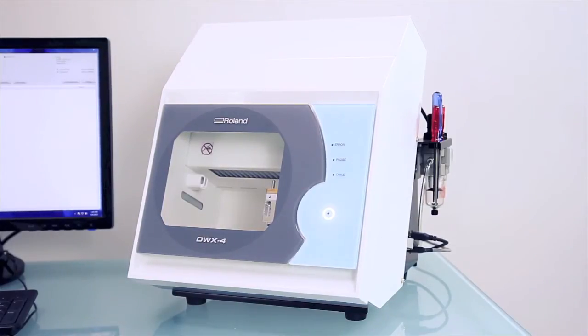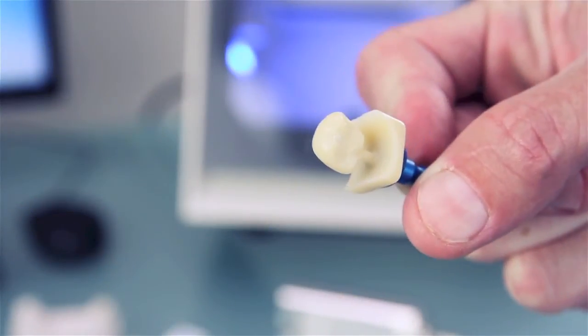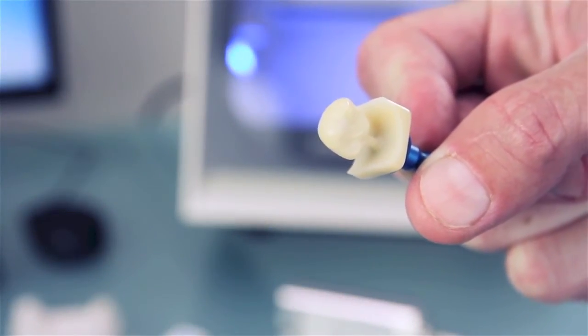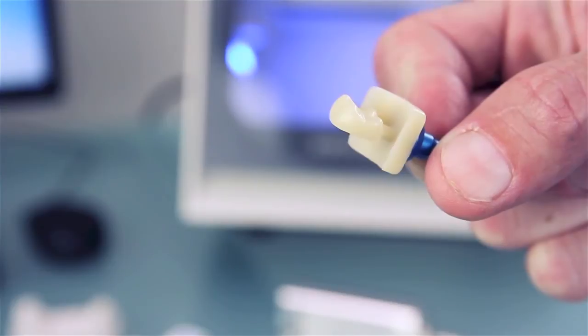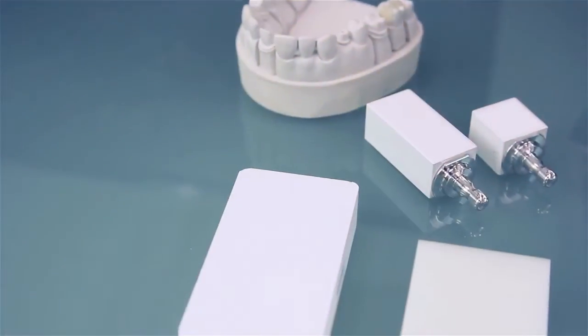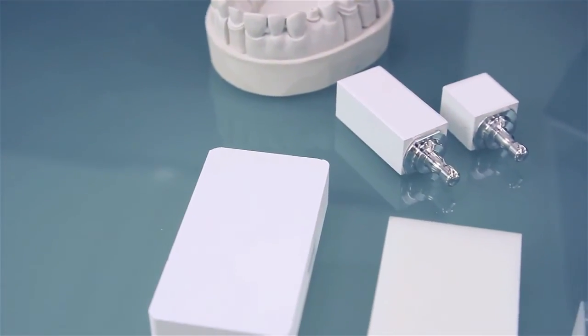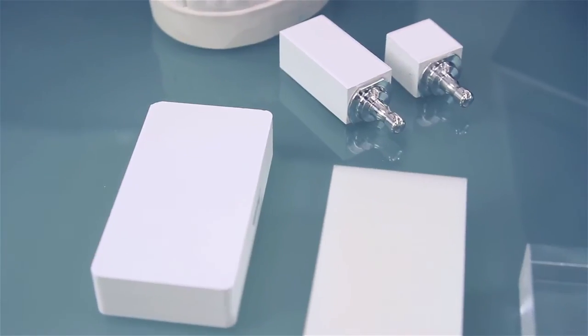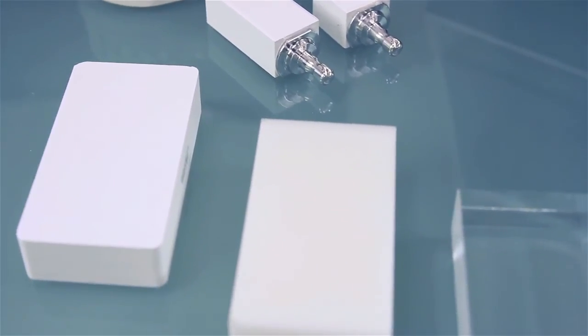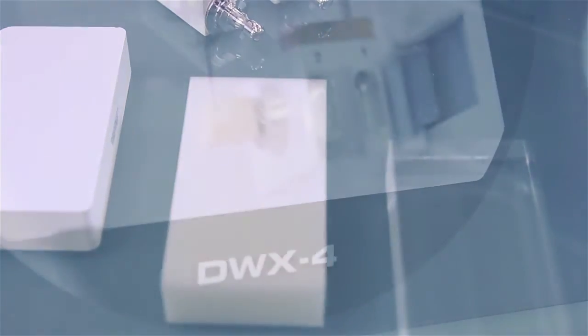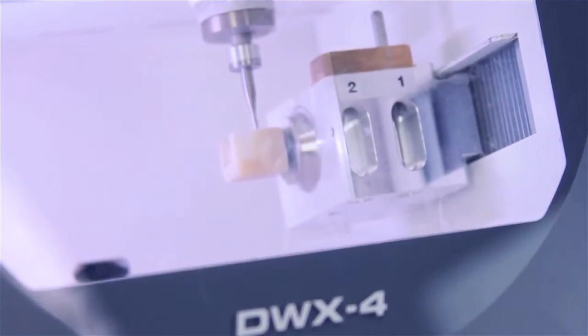The DWX4 is small but features the same precision milling as our popular DWX50 dental mill. It provides four-axis milling of standard block and pin-type materials including wax, PMMA, and zirconia. Now it's even more economical to mill a single crown or small bridge quickly.